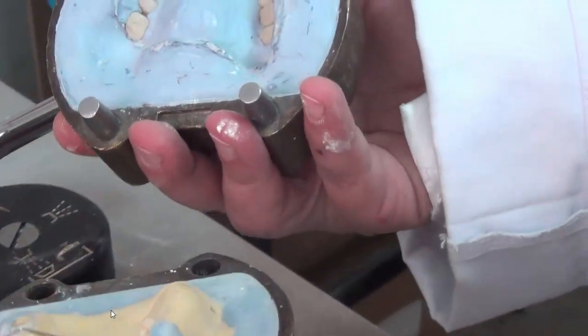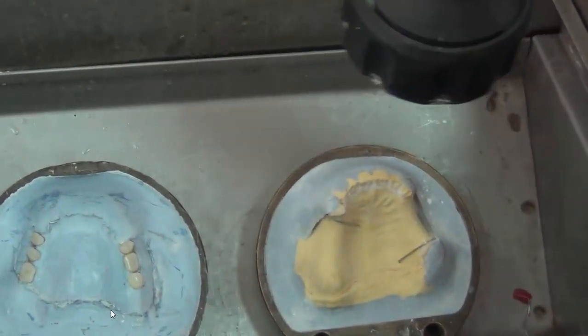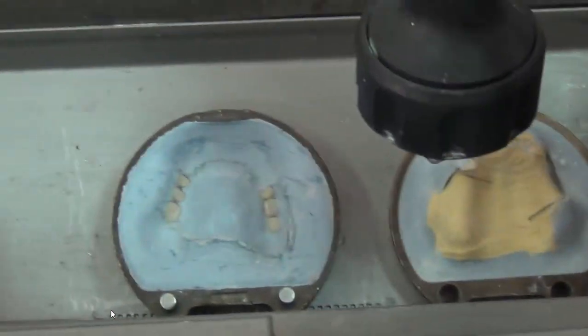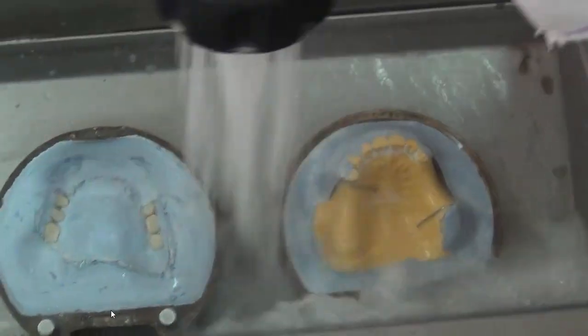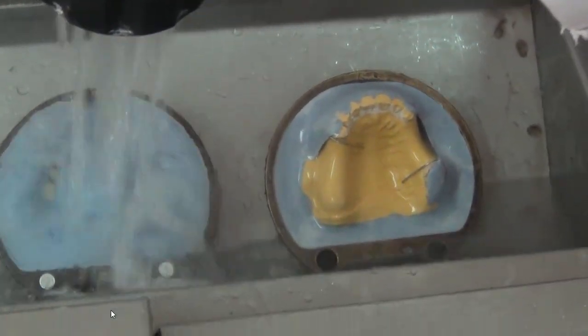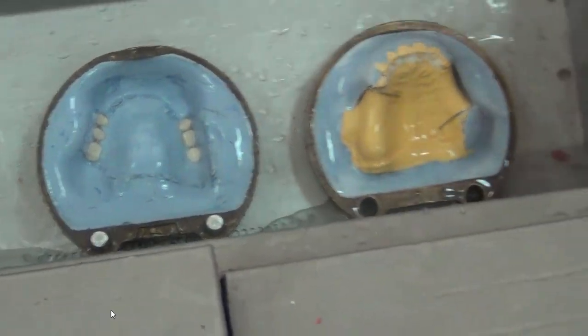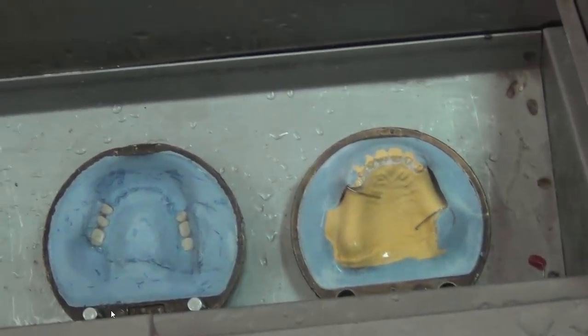So if we come to the flask here and open it, we will find that the wax is molten, and we put it back into here to do the final wash of the flask. So hot water will be running through here, and then we begin washing the upper and lower members. This step will eliminate all wax from around the teeth and from the cast.